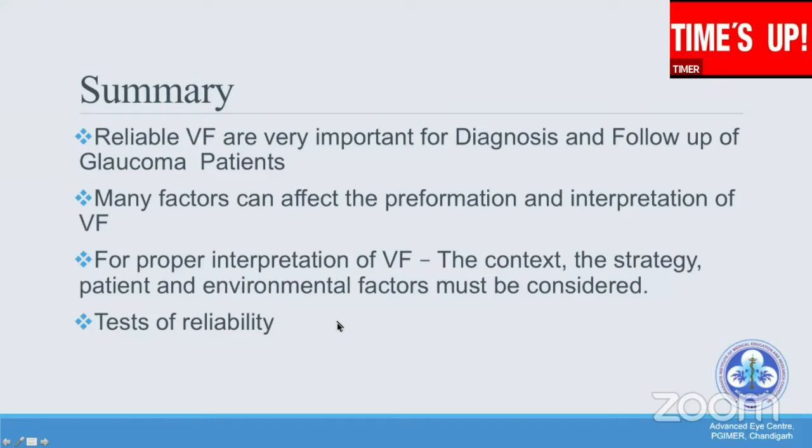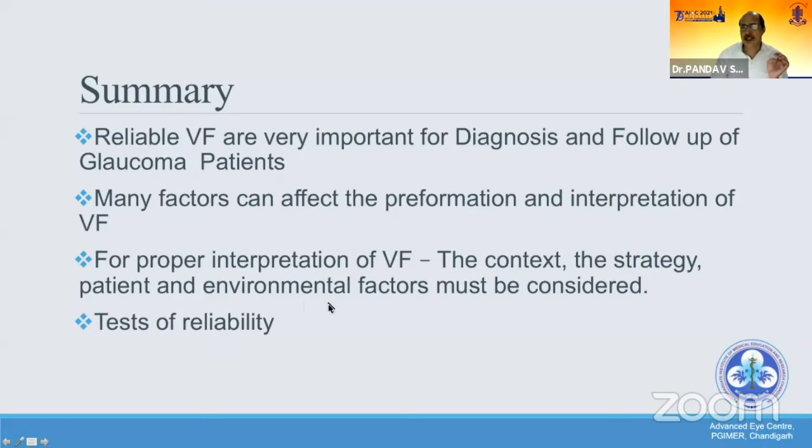To summarize, visual fields are very important for diagnosis of glaucoma patients, and many factors can affect the performance and interpretation. So for proper interpretation of visual fields, the context, the strategy, the patient, the environment, and many other factors should be considered.